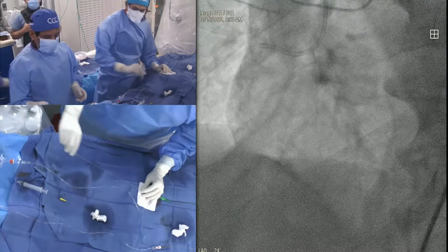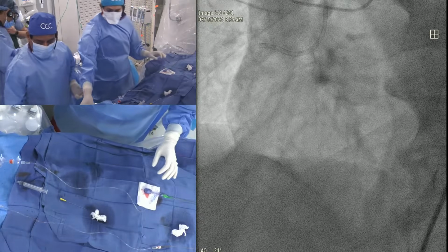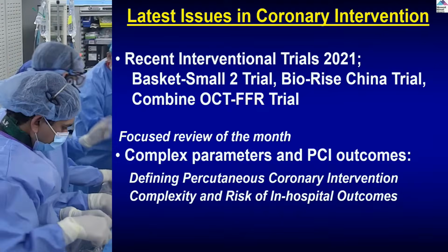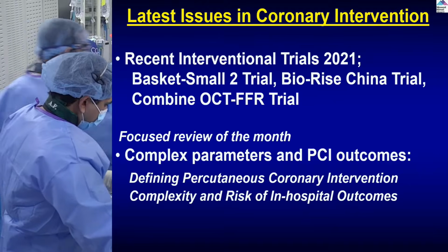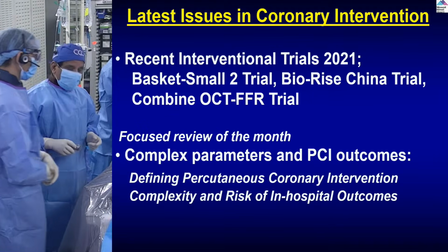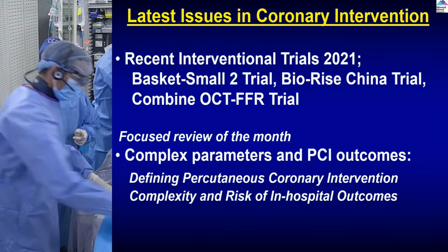But let's get a Fine Cross. We have it. Good. So that's one of the reasons. And while we are getting it, let's go to our presentation. So we are getting it now. Tell us what you're planning now. No, I will go Fine Cross. Okay. And then I'll make a decision whether I go back with the. I think you were right. It took us, you see that it took us outside. Put a Fielder wire again.